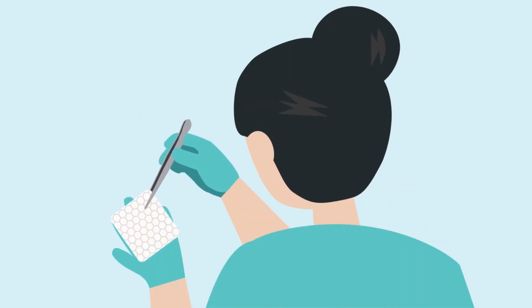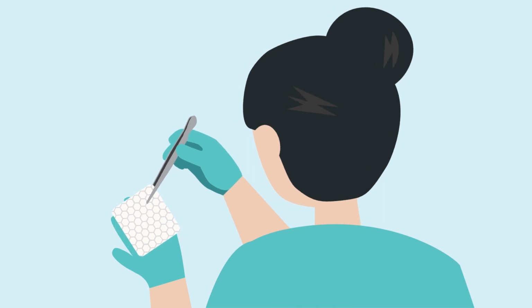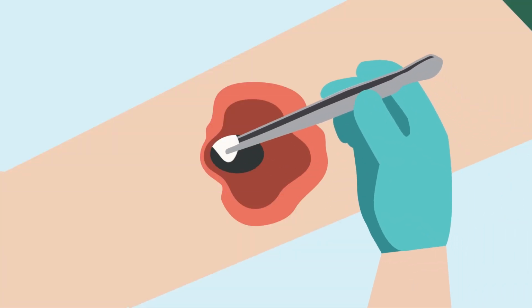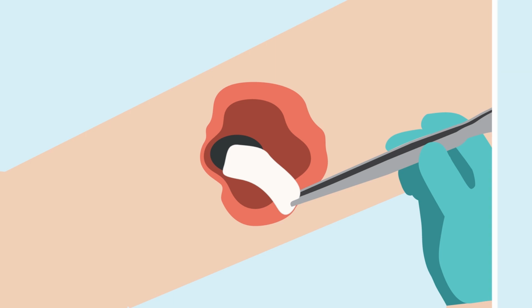It should be good at absorbing and retaining large amounts of exudate. It should not shrink when absorbing the exudate. That can lead to gap formation, leading to exudate pooling and increased risk of maceration. The dressing should be easy to remove in one piece from the wound. If it has poor tensile strength, it can lead to the dressing breaking up and leaving residues in the wound.